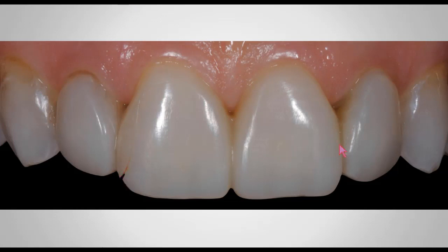Now, the prototype doesn't come out. It's just a little fracture. Everything is in place. It's not like the temporary came off and now she's got these spaces, half of her mouth. You can see that they're still bonded.